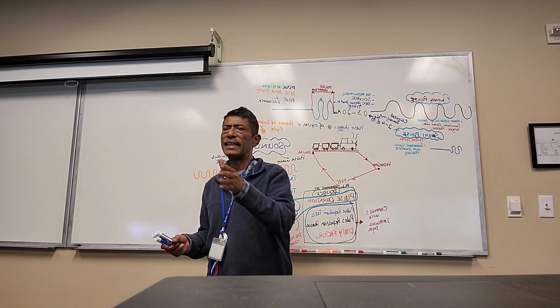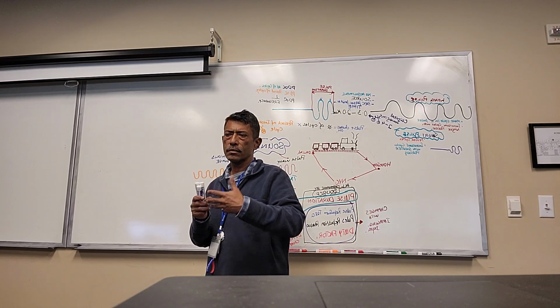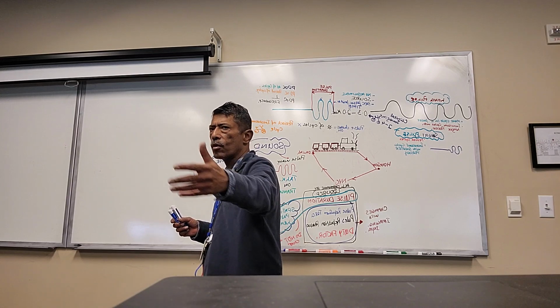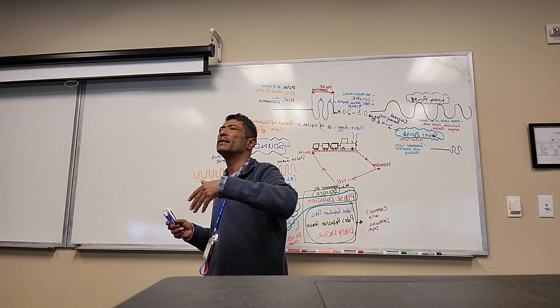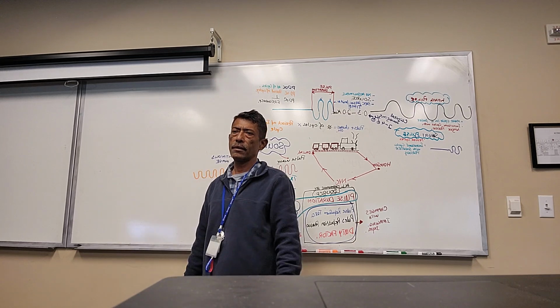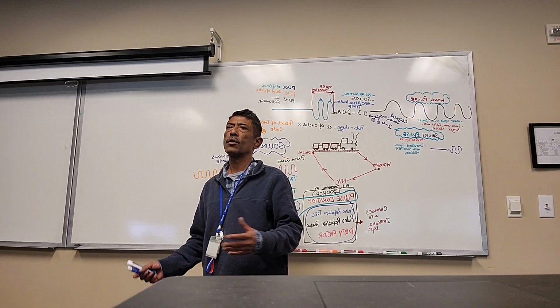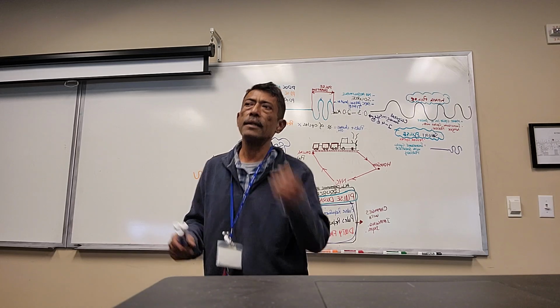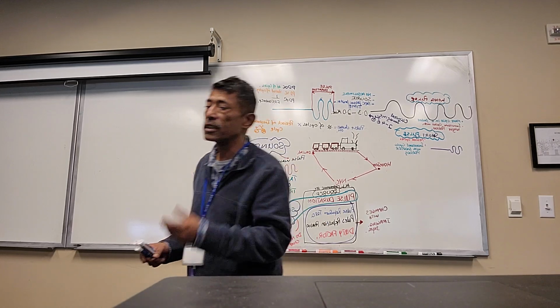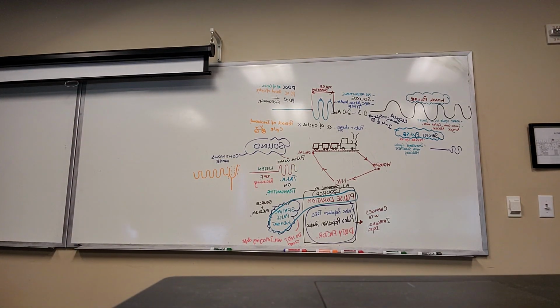Will that occupy more distance, or something with more cycles with longer period of an individual cycle? Shorter, less space; longer, more space. So spatial pulse length is the distance a pulse occupies out there.